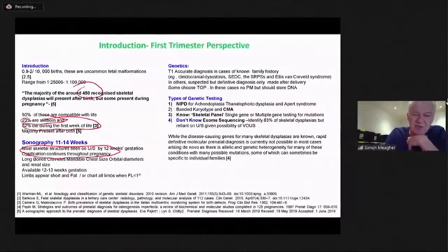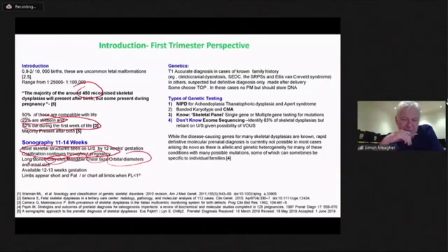Also, there are charts not only for the long bones, but for the clavicles, the mandible, the chest size, the orbital diameters, also renal size. These are all available for 12 to 13 weeks of gestation. So if you are suspicious, you can get to a certain point in trying to phenotype a fetus, particularly if you're looking at throwing a skeletal panel in the mix after a chorionic biopsy.